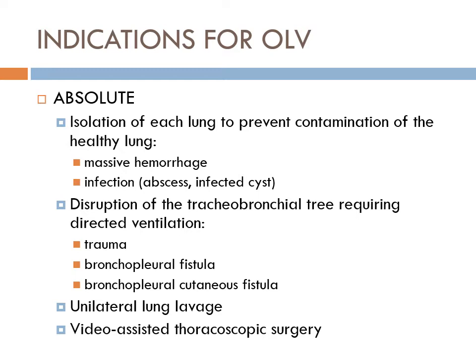Yeah, so we technically go pediatrics. I'm trying to relate everything to you guys so we can all get this whole clinical thing. In pediatrics, actually anything, we really never have a manometer in the room, but in pediatrics we're more concerned about overinflation of the cuff, which is going to be a big topic with thoracic anesthesia, especially when we come down to this cuff.